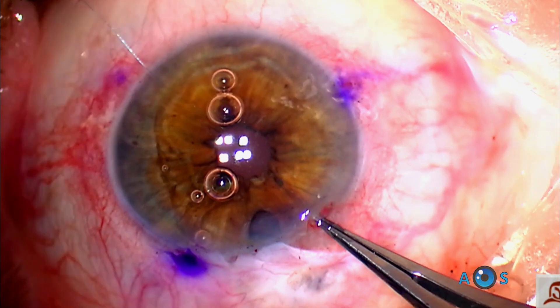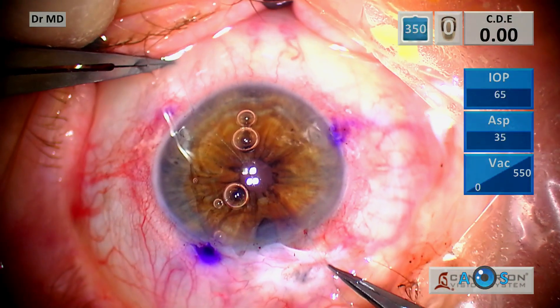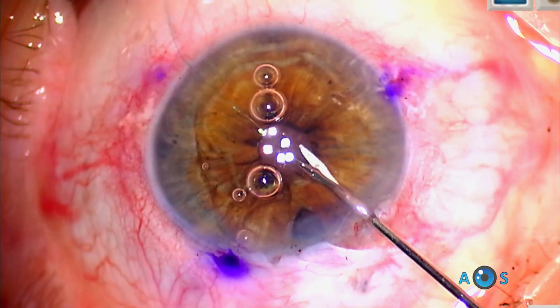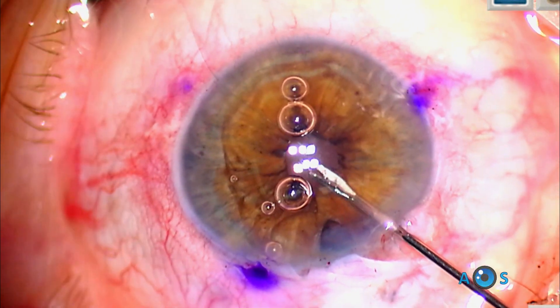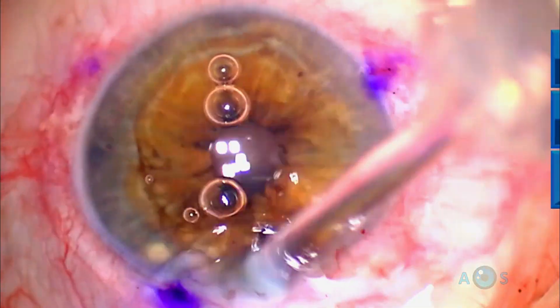A perfectly centered round pupil is achieved and this beautiful technique is completed. Thank you.